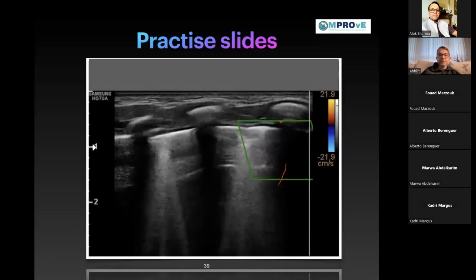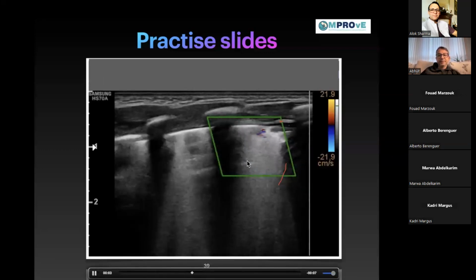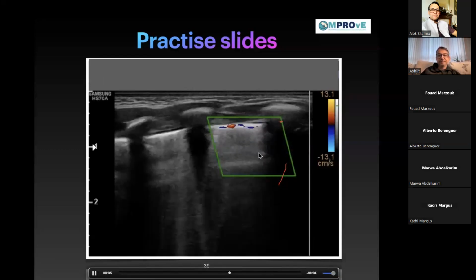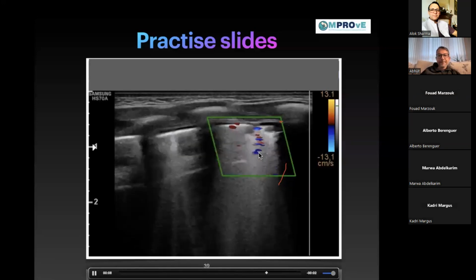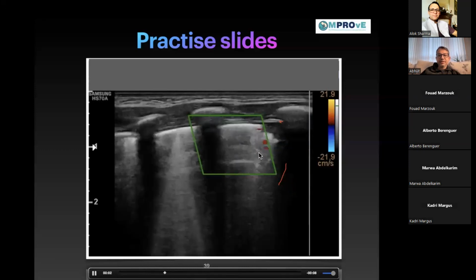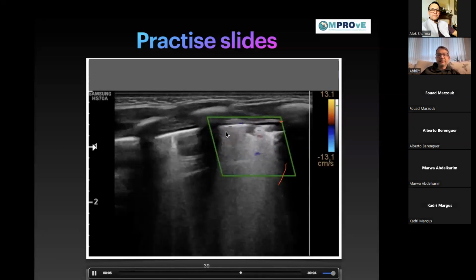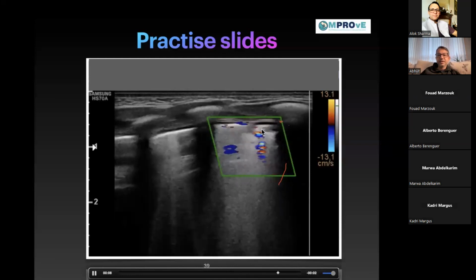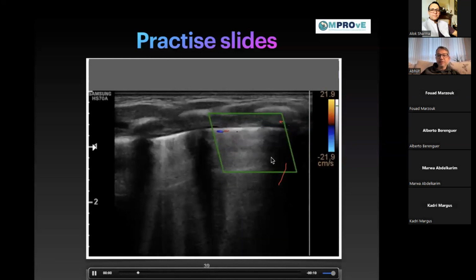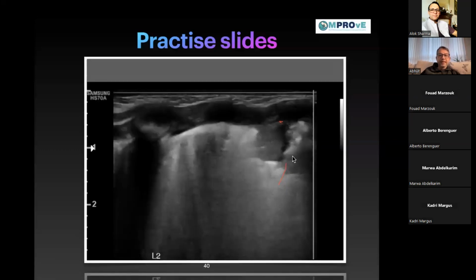And then what do I do? I do Doppler, and that's what we get. The vessels coming in the picture. You might ask which is the vessel here. So ignore these markings that come and go in appearance and disappearance. The vessels look like a long cylindrical tube. And you will see better on the next one, maybe.